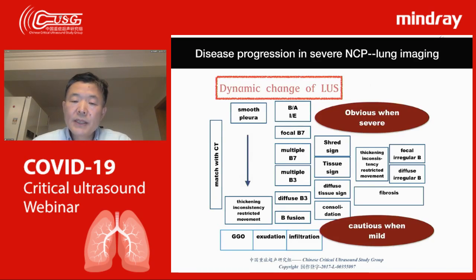So if the patient's condition is mild, moderate, or even no obvious fevers or signs or symptoms, the patient's condition is okay, our lung ultrasound is nearly okay.